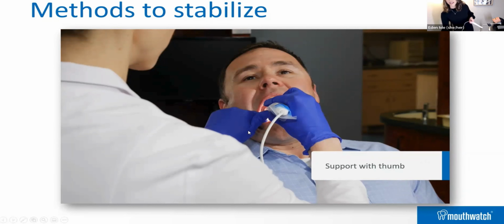All right, support with thumb. This is another one, like I like to retract with my finger, and then I can fulcrum on my thumb. I can rest that. It's a little bit of a modification of the shooting pool. I can rest this camera on my thumb.